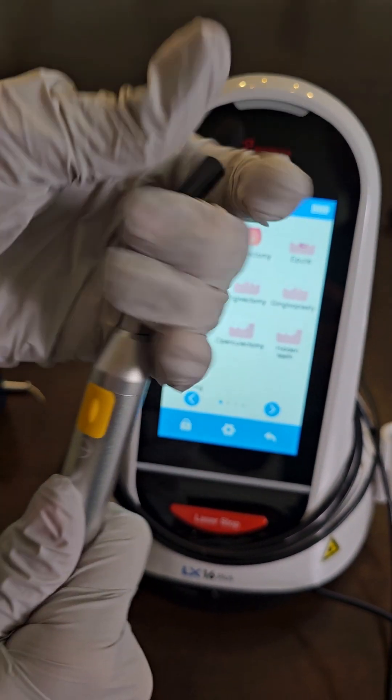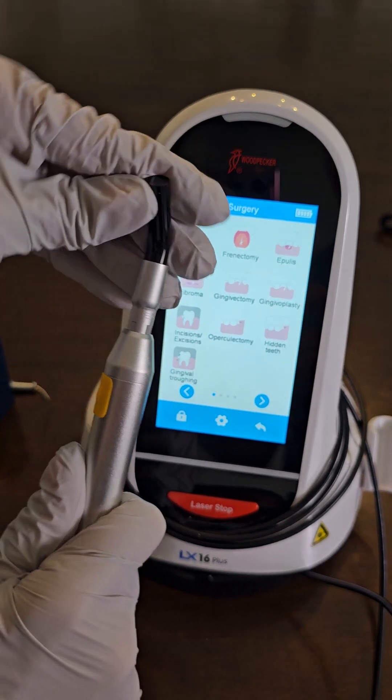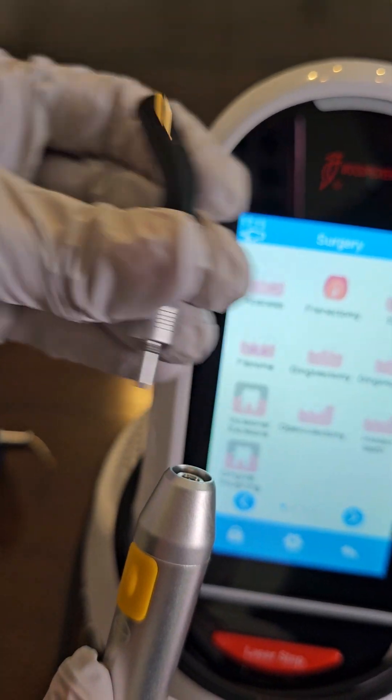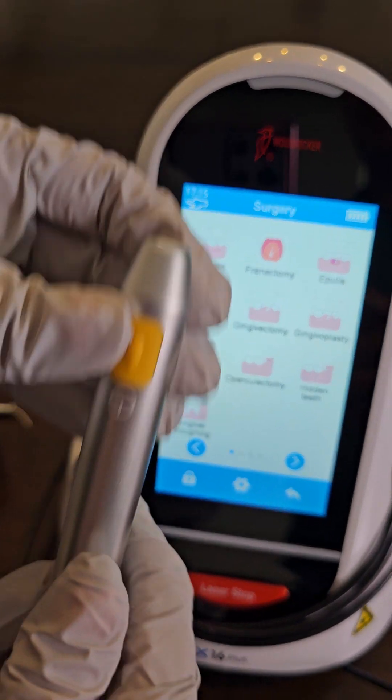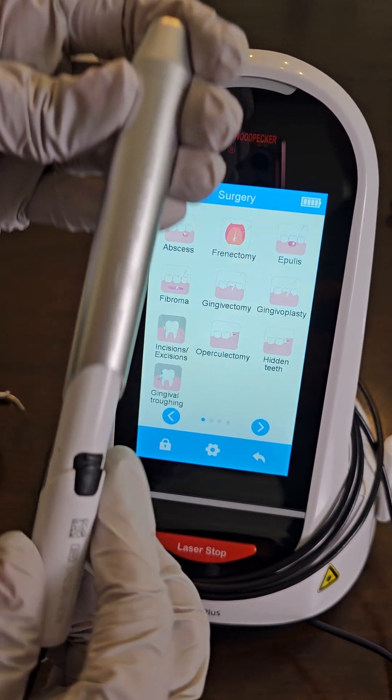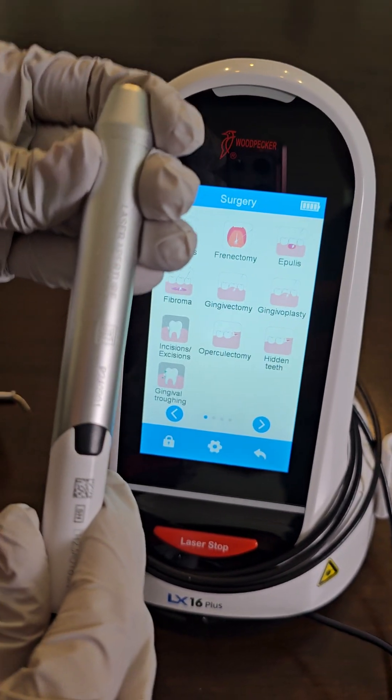Also, these handpieces unscrew counterclockwise. The handpieces come off and are autoclavable. You press that little black button, slide that off, and make sure it's clicked back on.